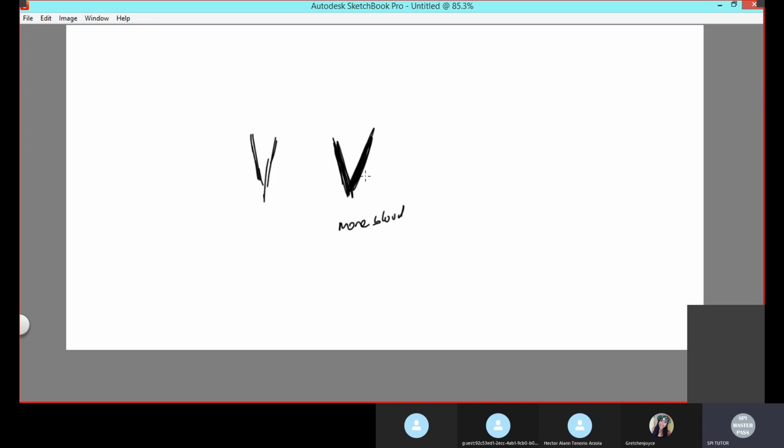And again, for echo, this is important because when we look at, let's say, regurgitation, which is the leaking of a valve, if there is a leak but the waveform is not so bright, we can say there is a leak, things are coming back, but because it's not very bright, not a lot of blood is coming back.